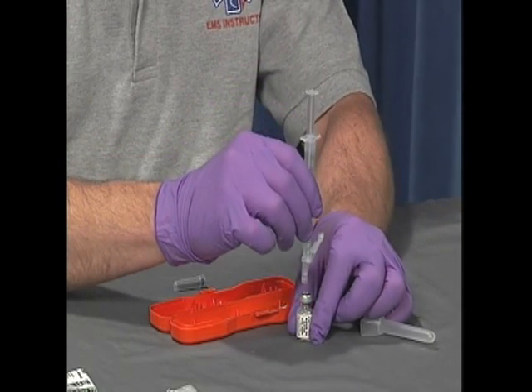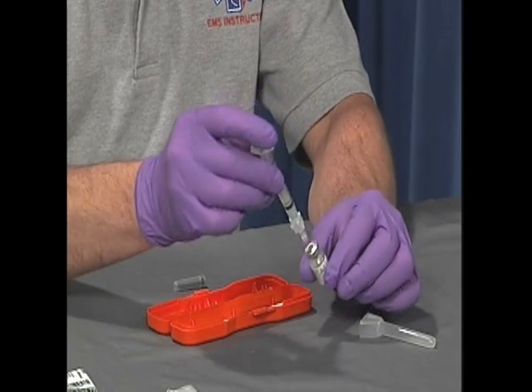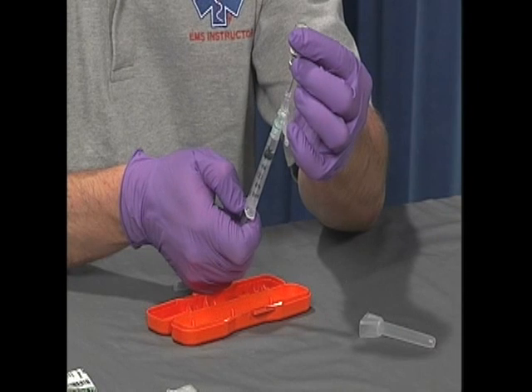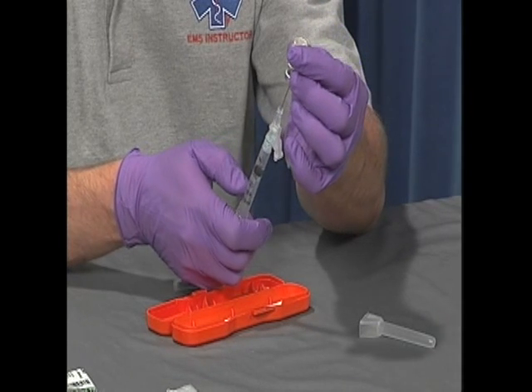Pierce the center of the vial stopper with the needle on the syringe and inject the air. Holding the vial upside down in one hand, be careful to keep the other end of the needle within the fluid level of the vial. Also, consider the exposed portion of the needle sterile, so it should not be touched.